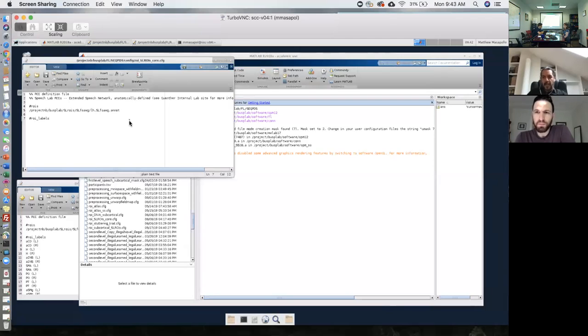Yes, exactly. All of these ROIs are defined on FS average space. So if possible, the best way is to apply them on data that has been run through our surface-based pipeline, through FreeSurfer, so we know where the cortical ribbon is, and they are in the proper space. We know how to map FS average to its subject cortical anatomy. Worst case, when we haven't run the data through FreeSurfer and still want to use these ROIs, there is a workaround, but it's not recommended.